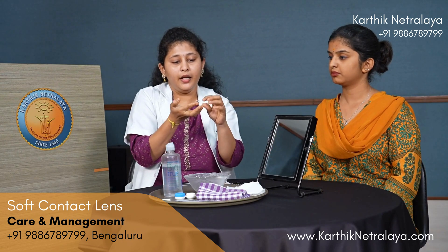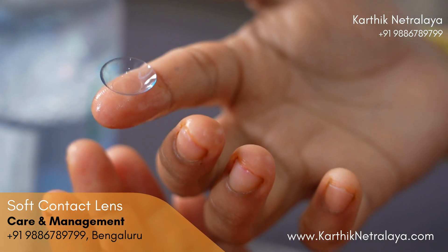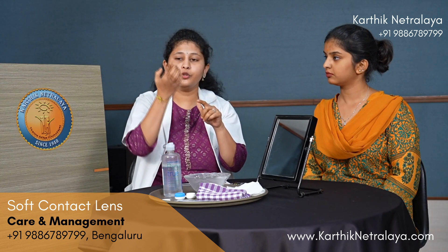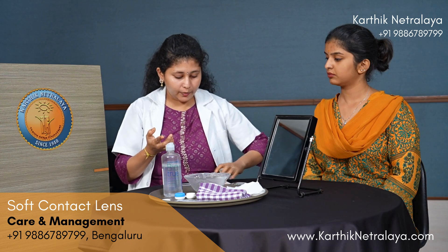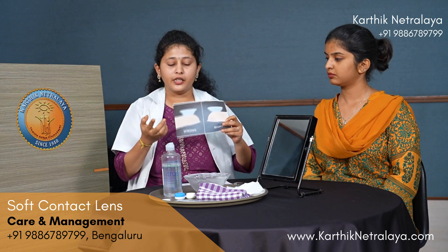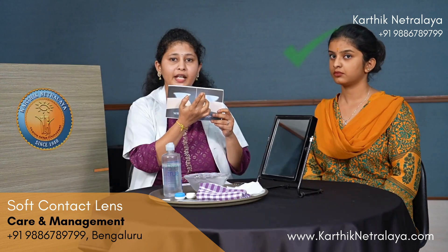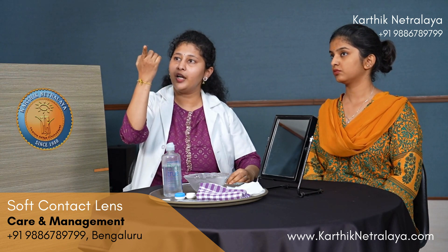Take the lens in your palm and then place it on your index finger. Before wearing, you must make sure the direction of the contact lens is correct. Hold it opposite to the light and check — this is called the taco test. In the image, the side where the lens shape is like a bowl is the right direction, and the side where the lens shape is like a saucer or plate is wrong. Check this every time before wearing.